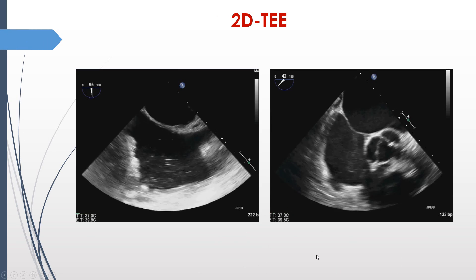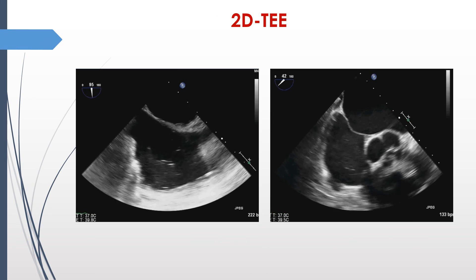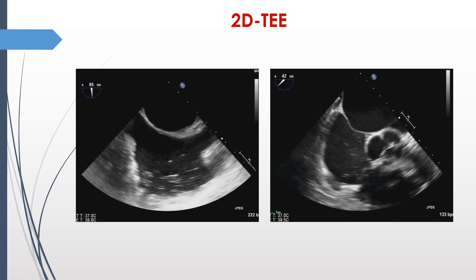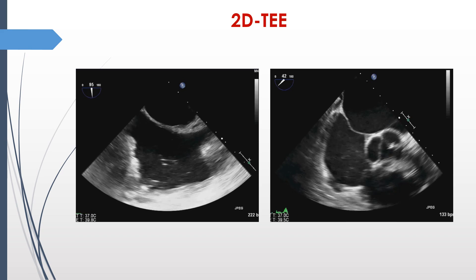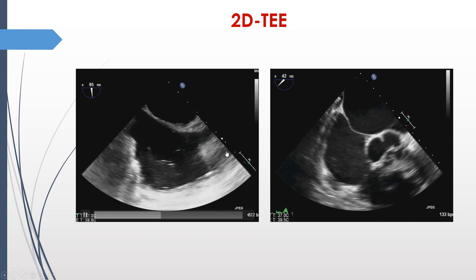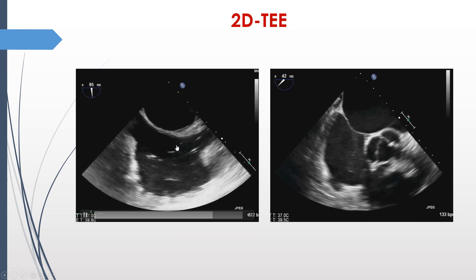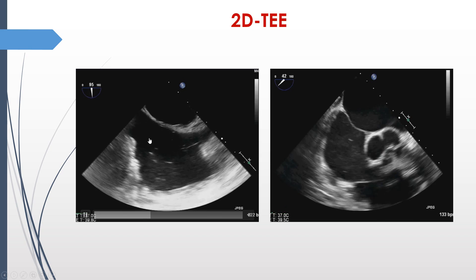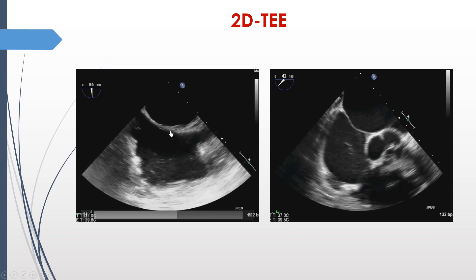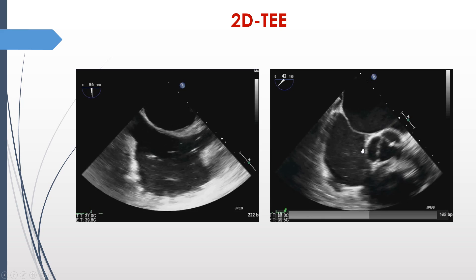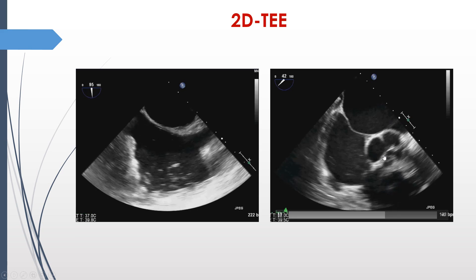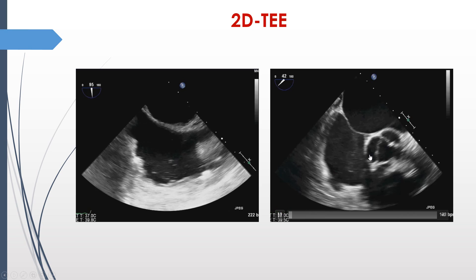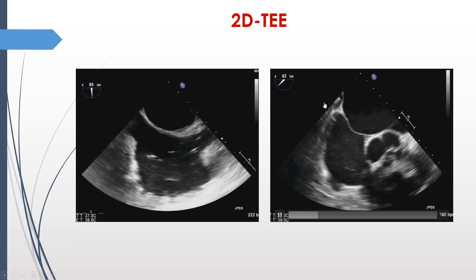If you are using only two-dimensional TEE, you have two basic views to start with when imaging the septum or guiding transseptal puncture or septal crossing. You have the bicaval view, which is at around 90 degrees, showing what is superior and what is inferior — here is the superior vena cava, inferior vena cava, left atrium, and right atrium. And you have the short axis base view, which usually shows you the anterior-posterior relationship once you see the aortic valve — so this is anterior and this is posterior.